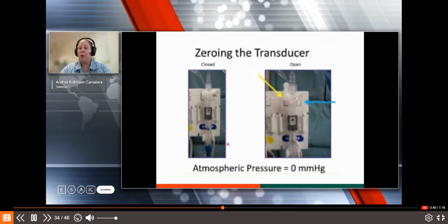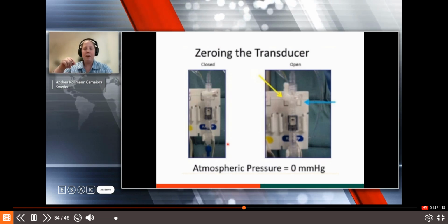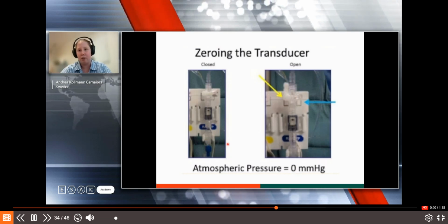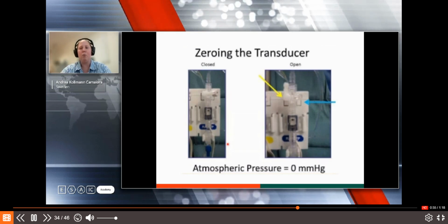So what we have done to simplify the process is we tell the machine, first sense this environment, this you're feeling, which is the atmospheric pressure, that's 0. And then whatever you feel on top of that, then that's the value I want to know.